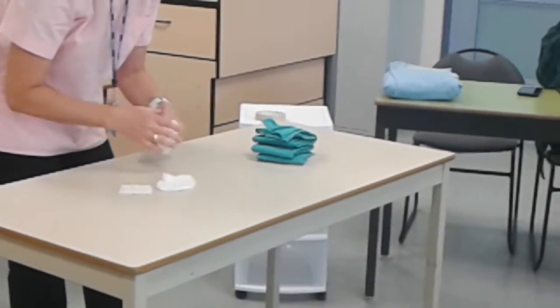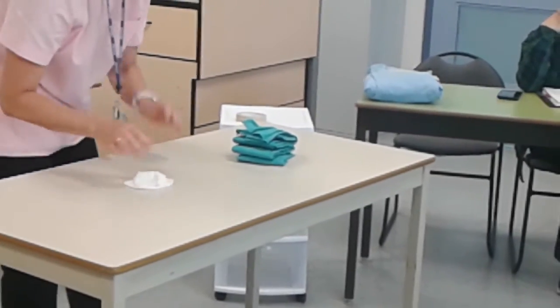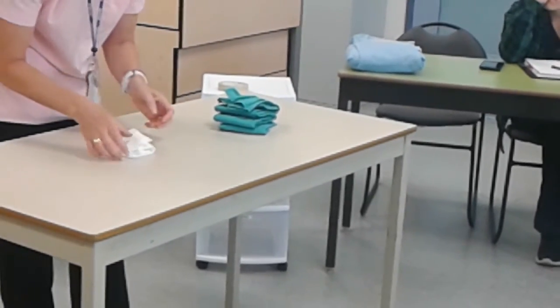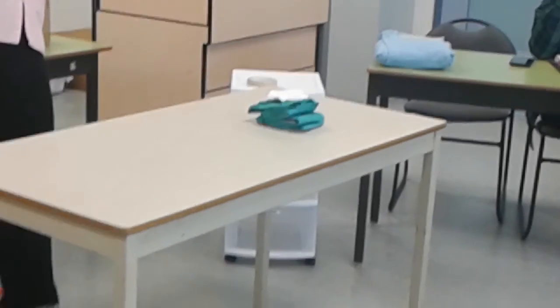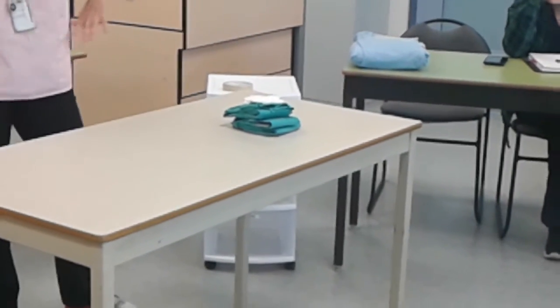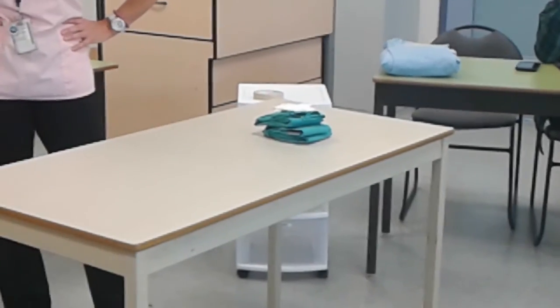So I've got six gauze squares — one, two, three, four, five, six. I'm going to put those on the top of there, and I'm not going to forget my chemical indicators. I'm going to put this on there, and then I'm just going to go ahead and do the wrap.